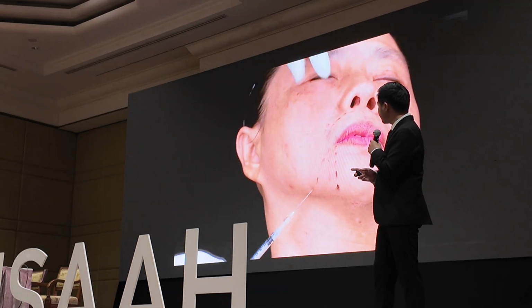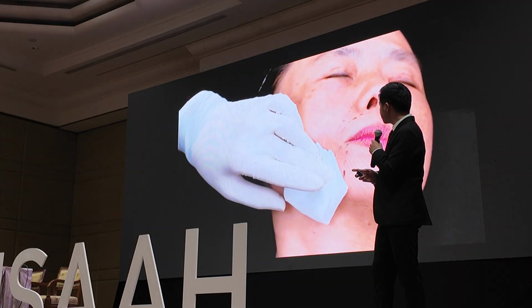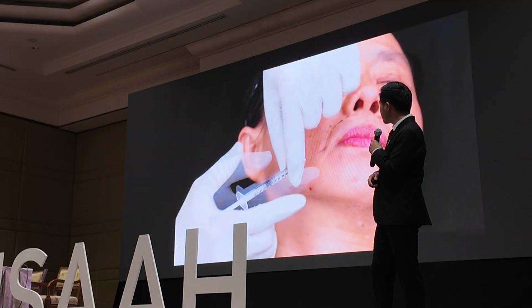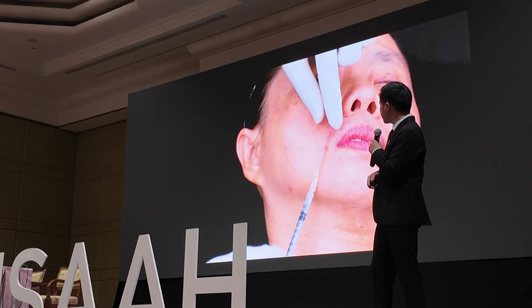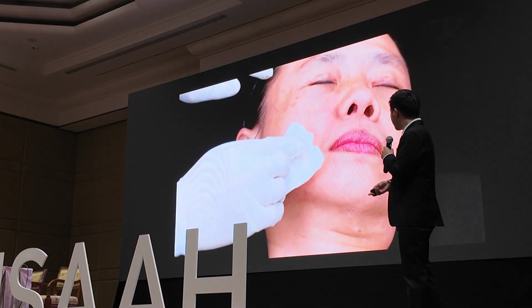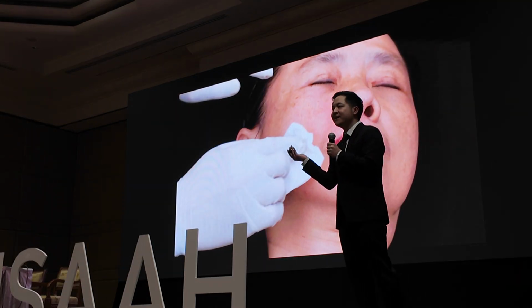This area will help for the marionette line too. Okay, I will let you see just one side, okay?